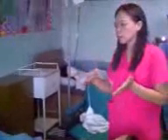Okay, so you have to elevate the head of the bed gradually. So, let's say 5 degrees, 15 degrees, 35 degrees, 60 degrees. So, gradually. And then, upon elevating the head of the bed, you ask the patient, ma'am, do you feel dizzy?